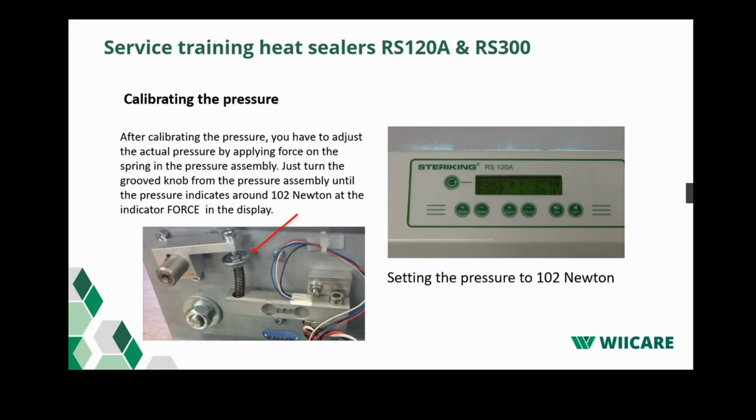The next part after you did the real calibration in the machine, now you have to make sure that the pressure on the pressure roller is set to approximately 102 newtons. So you did the calibration, and now you will put some new force on the pressure roller. That's where it's shown now. And by doing that, you can turn the little nut, which is here. It's a groove nut. Then you have a little screw above it that's just to fixate it after you set it to 102 newtons. We need to adjust it to 102 newtons.